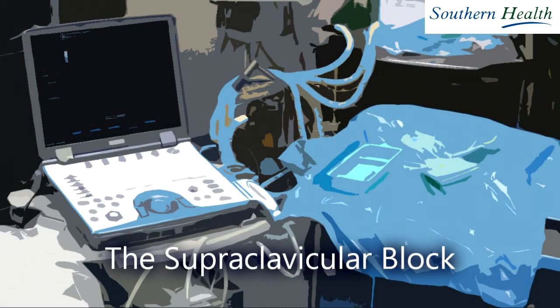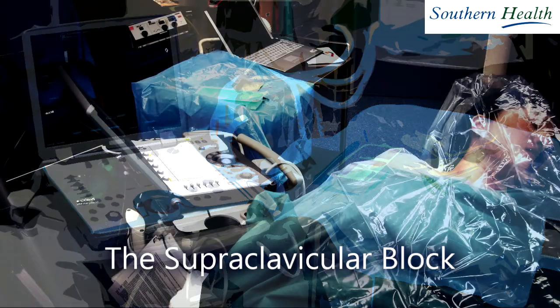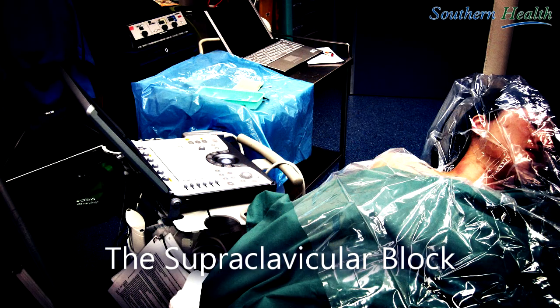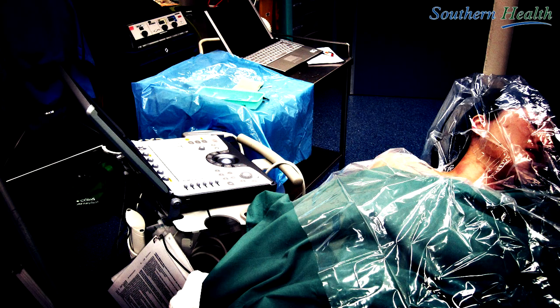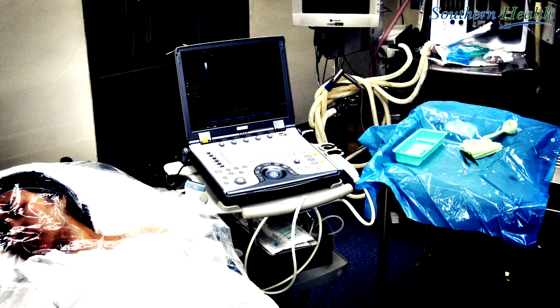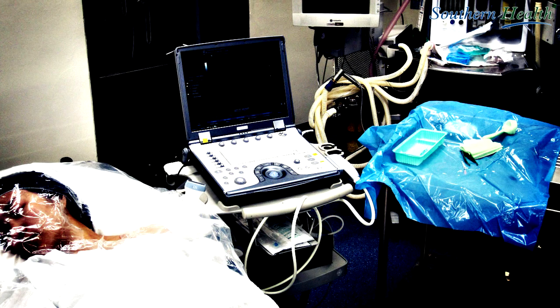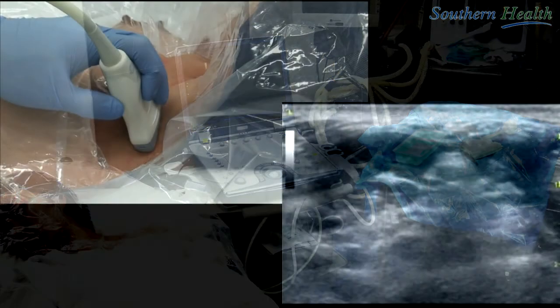The supraclavicular block. This demonstration is for a left-sided supraclavicular block.